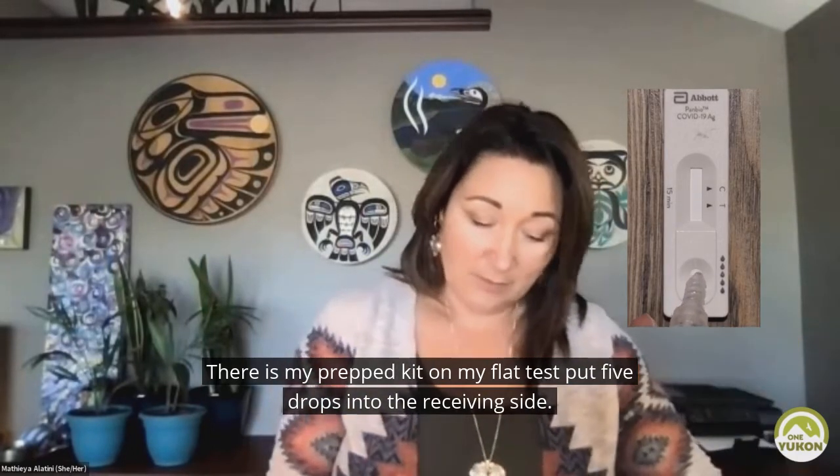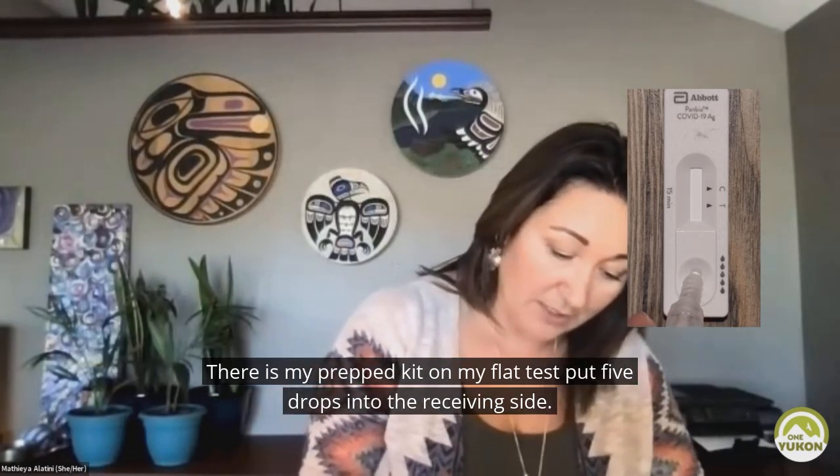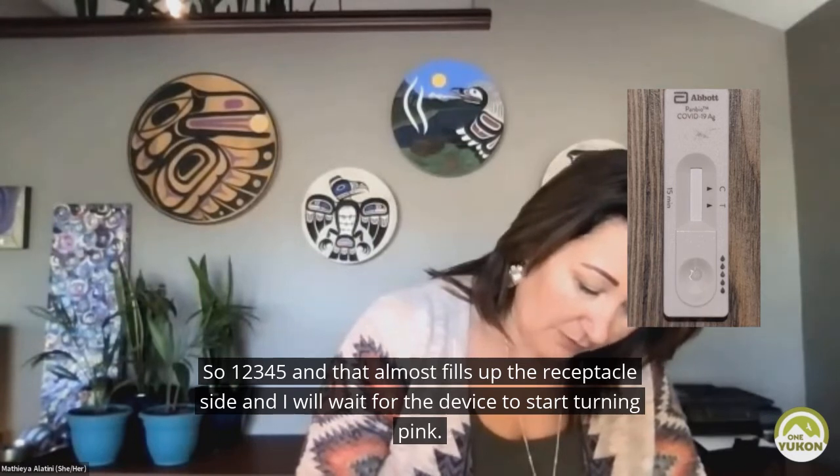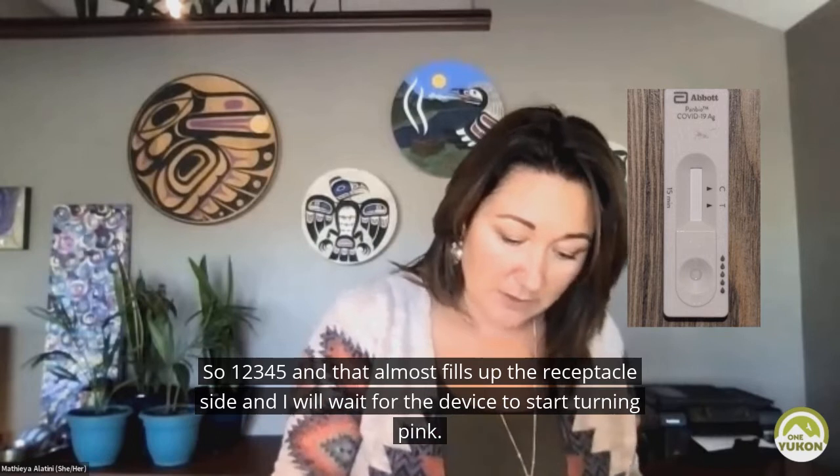On my flat test, I'm going to put five drops into the receiving side — one, two, three, four, five. And that almost fills up the receptacle side.